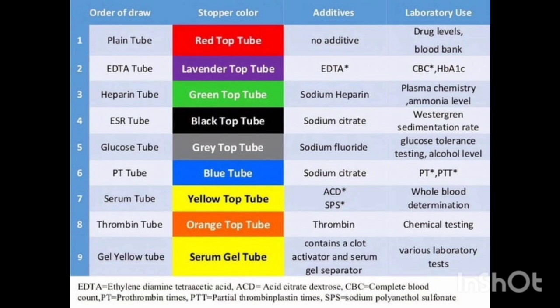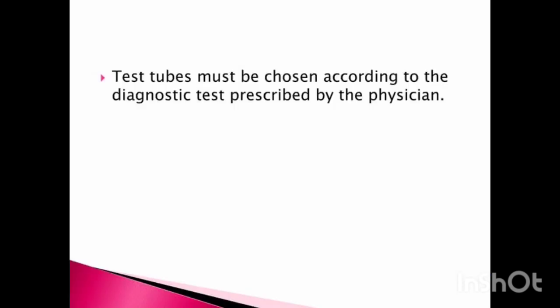So with the help of the color of the tube cap you can identify them and you can use them for different types of blood investigations. You must choose the tube according to the test prescribed by the physician.